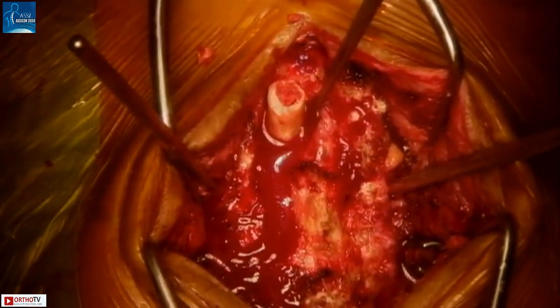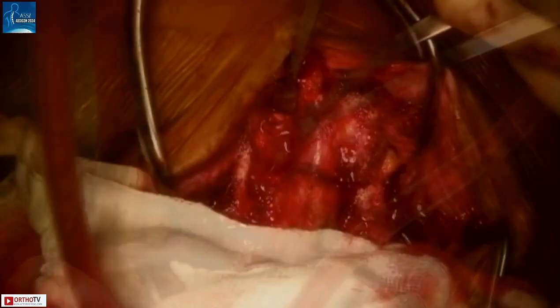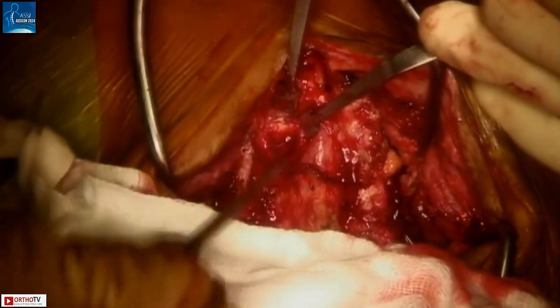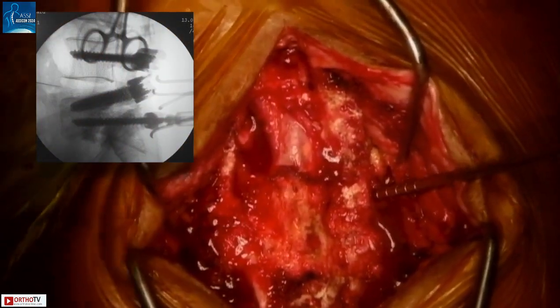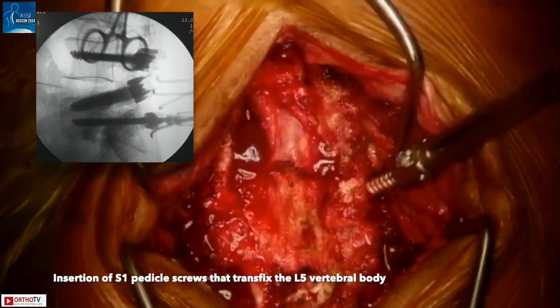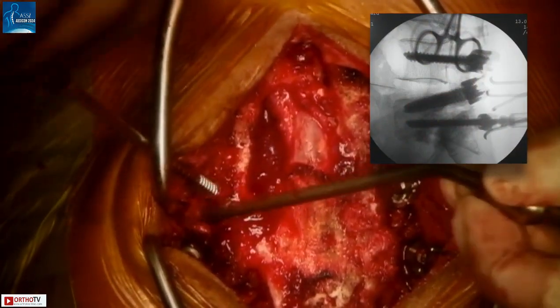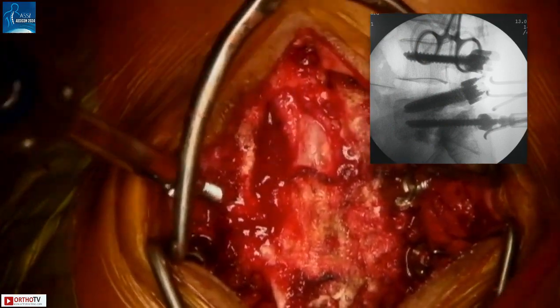As the fibula is advanced, it transfixes the sacrum and the L5 vertebral body. The proximal end of the fibula should sit flush with the posterior wall of the sacrum, and any bony projections above this level can be nibbled off. The surgery then moves on to the remaining instrumentation. The S1 screws are inserted such that they transfix the L5 vertebral body on either side, done under lateral fluoroscopic guidance, taking care that the trajectory of these screws does not interfere with the inserted fibula. To protect these screws, S2 iliac screws are then inserted.